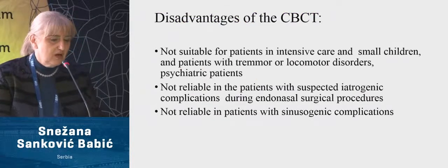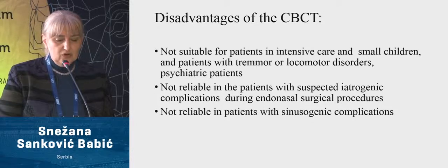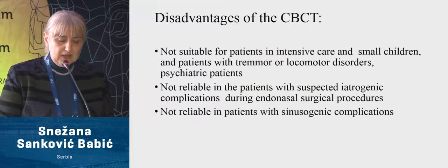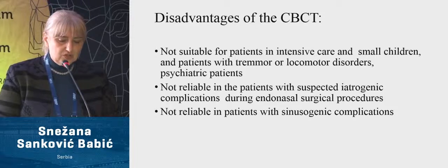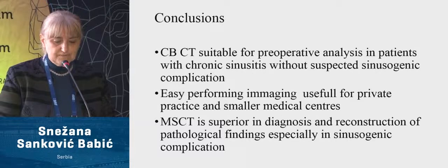Disadvantages of CBCT are that it's not suitable for patients in intensive care, and small children too. Not for patients with tremor and locomotor disorders, because we need our patients to sit perfectly still for 2 minutes. It's not reliable for patients with suspected iatrogenic complications during endonasal surgery, and of course for patients with sinusogenic complications.